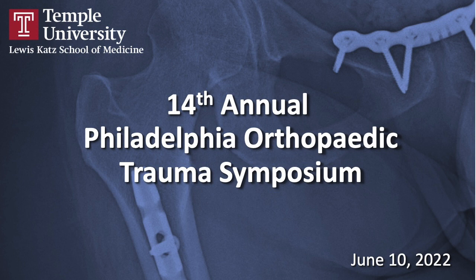Then I put my pins in, and then I do the I&D and debridement, because I don't like the idea of all that debris washing all over the drapes and all over the leg, and then theoretically driving some of that in as you're inserting your pins. Your hands are dirty, even if you change your gloves, the drapes are dirty. So I put in the pins, and then I go back to the wound and do my formal debridement. Then I add the frame, and that's worked well for me, so it's something to consider.